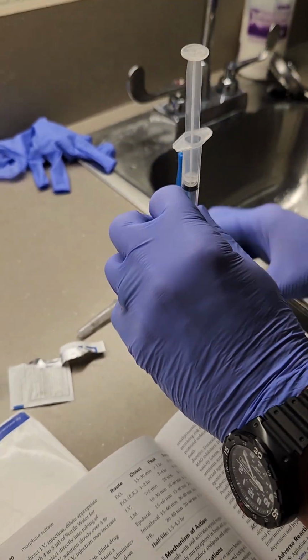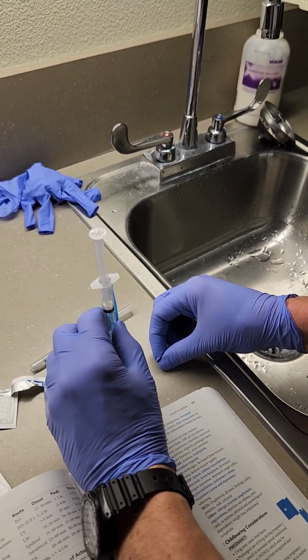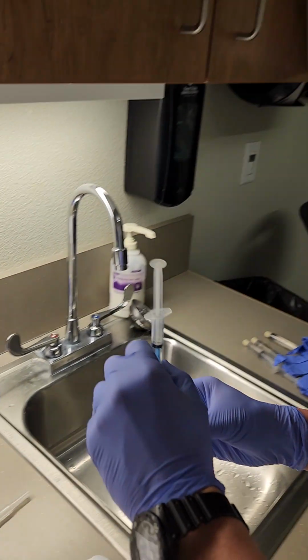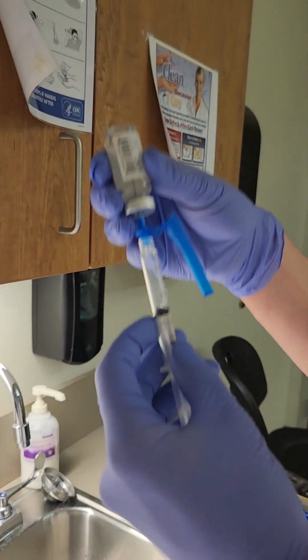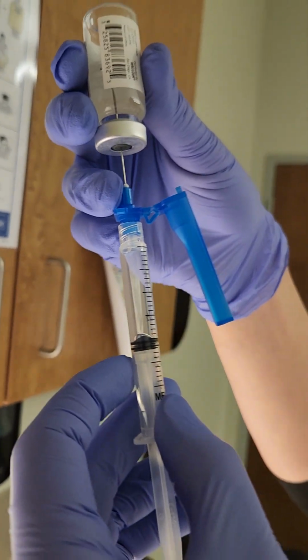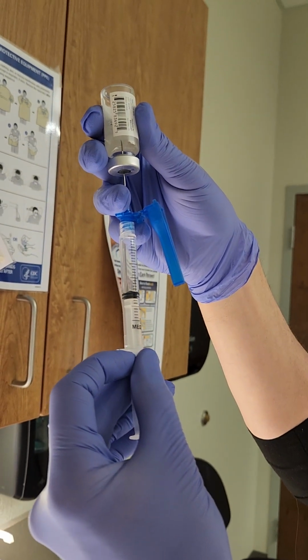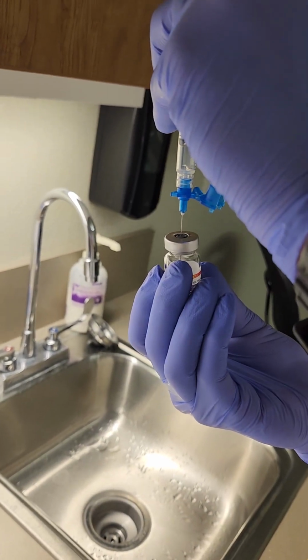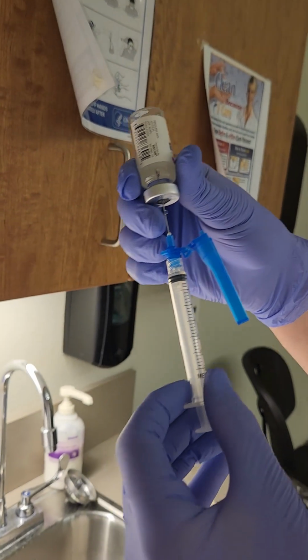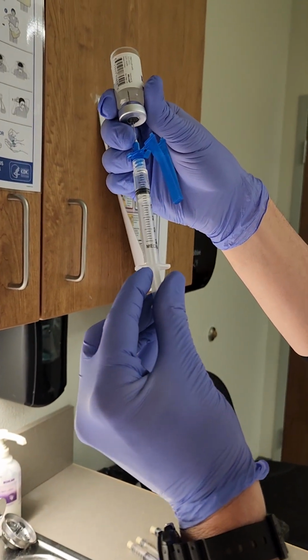So I am going to stick that, and try not to draw any air. Oh, wait a sec. I want to put the air in first. And now, I don't want to draw any air. Hopefully I won't.